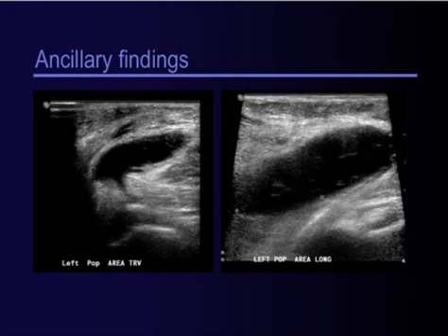And in order to prove that you are in that bursa, you want to demonstrate the medial head of the gastrocnemius and the semimembranosus tendon, and you want to show that the fluid is coming from between these two structures and extending into the cystic structure. And here we have the back of the tibia. So without those landmarks, you don't know what you're looking at.